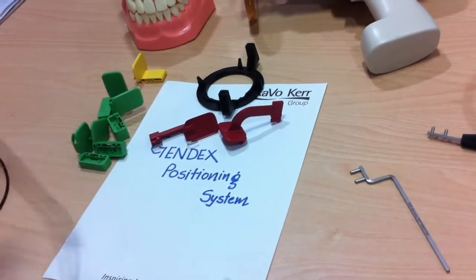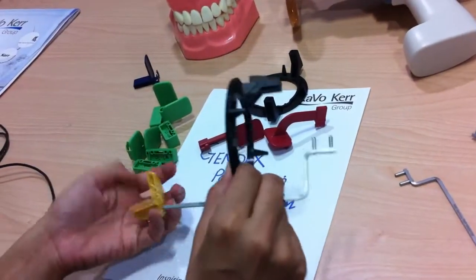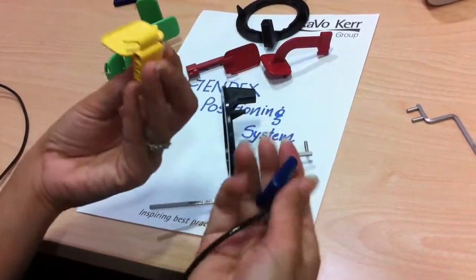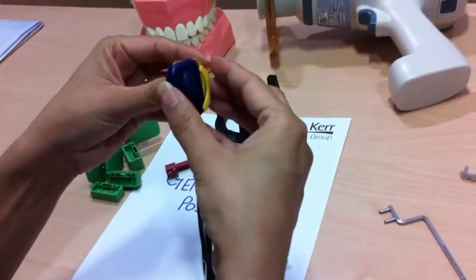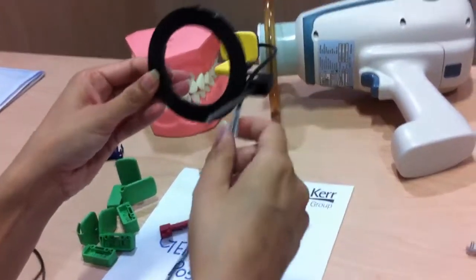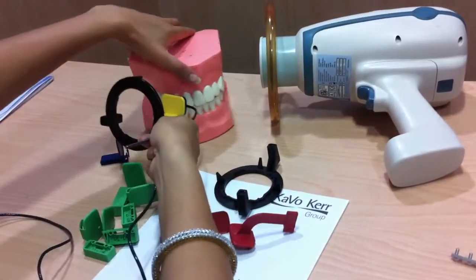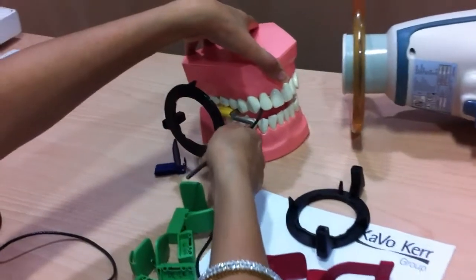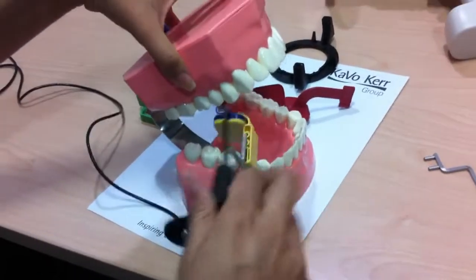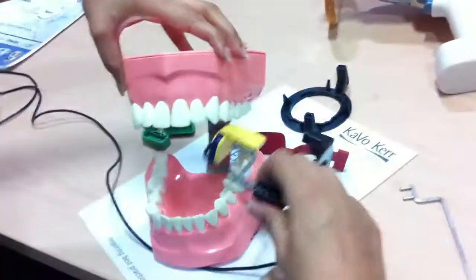The next is the yellow holder, which is for the posterior. The aiming ring and bar assembly are the same. We align the sensor so it is in the center of the ring. This is used for all the posterior areas — upper molars and then the lower molars, for both posterior uppers and lowers.